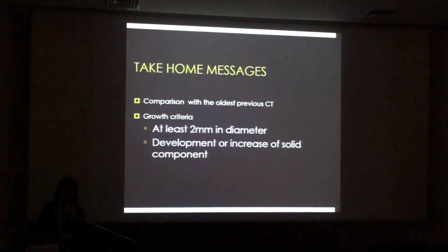Yes? When you say that a large solid component is a relatively better indicator of possible spontaneous resolution, is there a guideline for how large is large, occupying 75% of the lesion or some other amount?